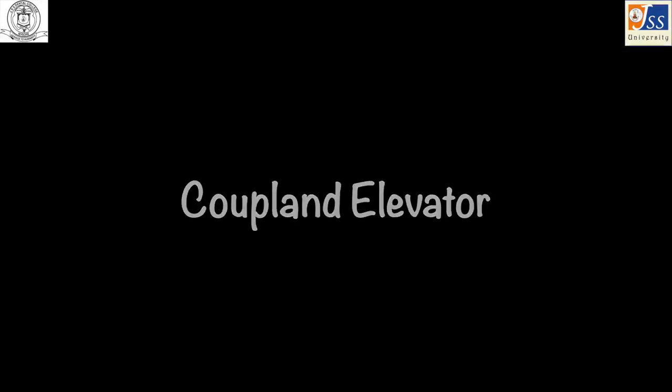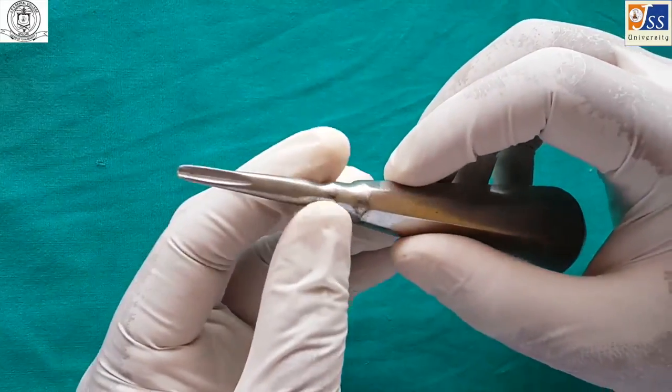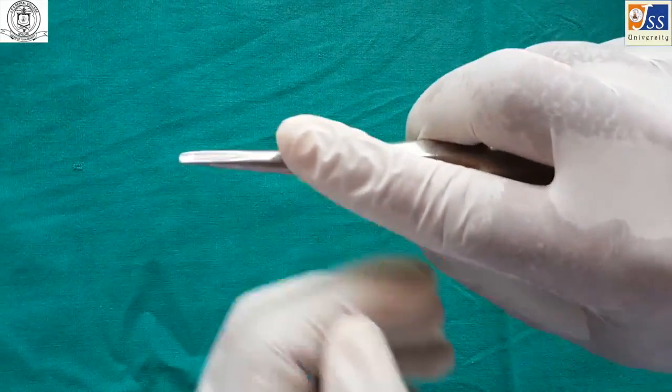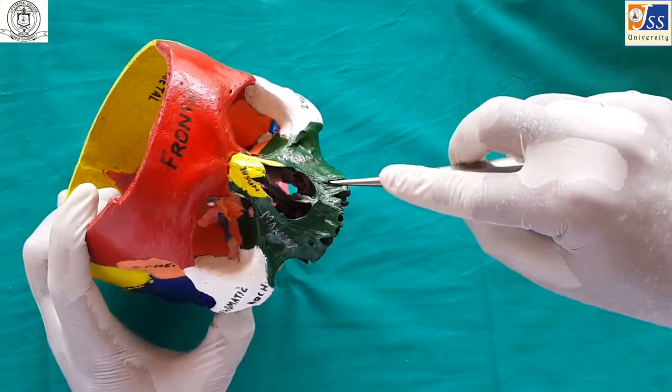Coupland elevator is held in a palm and thumb grasp and is primarily used on the wedge principle.